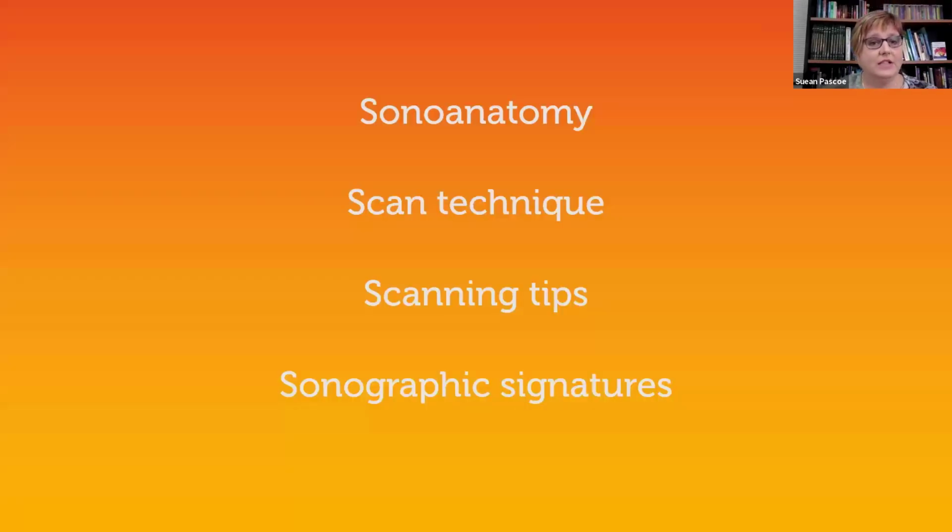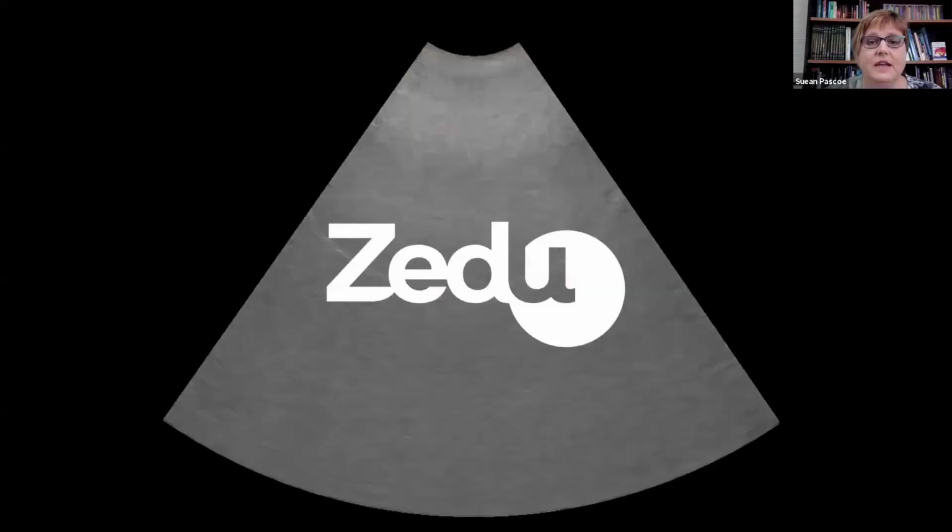So we've had a quick tiki tour of the pancreas, looking at the sonoanatomy, some scanning technique and scanning tips, and the sonographic signatures. So has anyone got any questions?